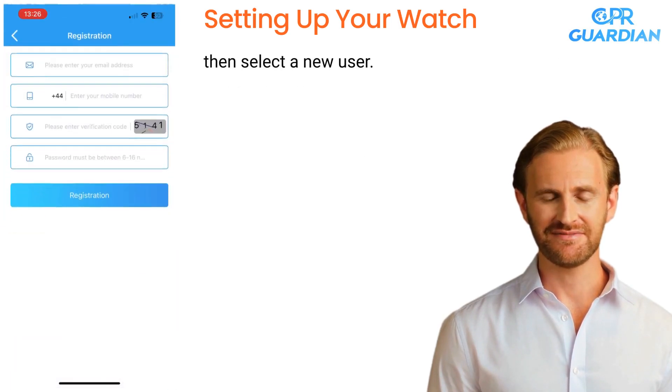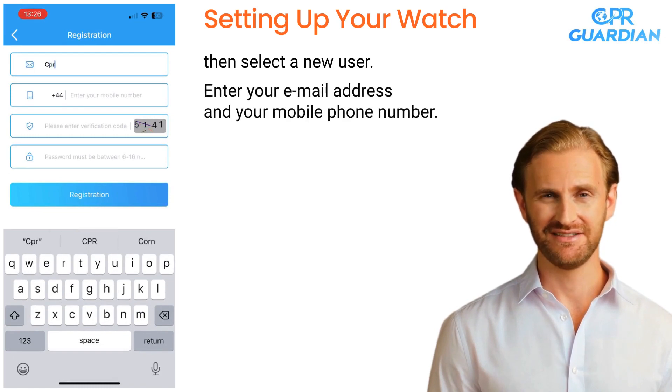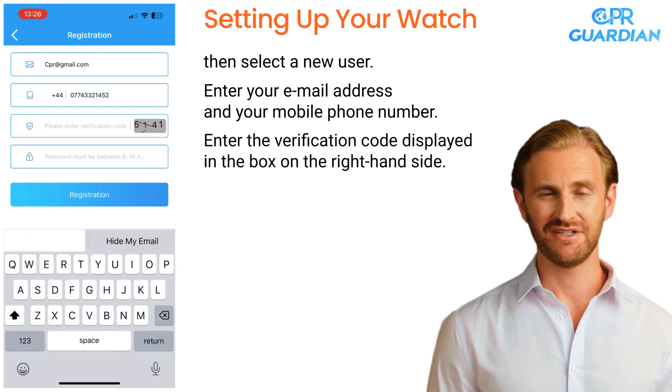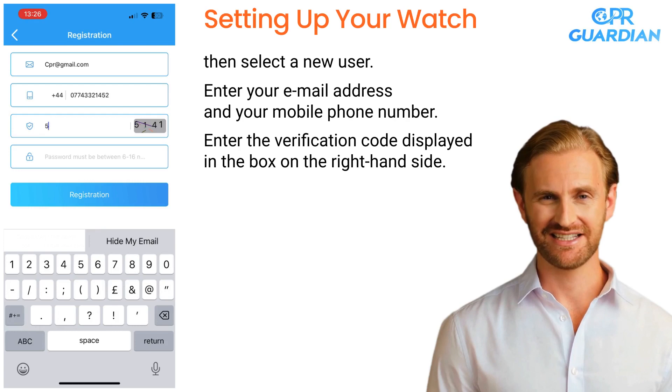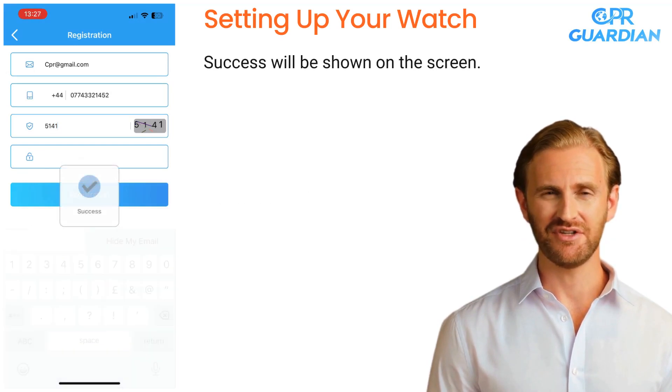Then select a new user. Enter your email address and your mobile phone number. Enter the verification code displayed in the box on the right-hand side. When completed, choose a password. After you have chosen your password, select Registration. Success will be shown on the screen.